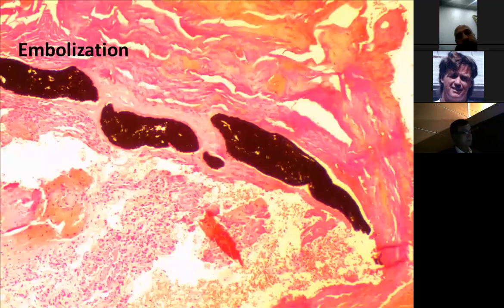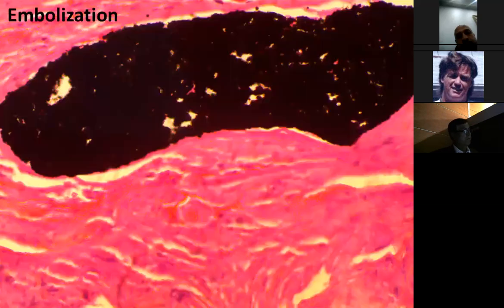This is a high power image. As you can see, these are the meningioma cells, originally from the arachnoid cap, the normal meningeal cells. This is the most common pattern. We can have other patterns like fibrotic meningioma, small cell meningioma, chordoid or clear cell meningioma, which is associated with a worse picture. And this is the embolization material, black in color inside the blood vessels and surrounding necrosis. The more prominent necrosis we can see in the wall of the blood vessels and the surrounding area. This is a higher power of the embolic material.